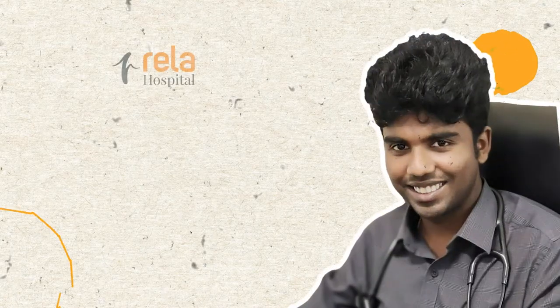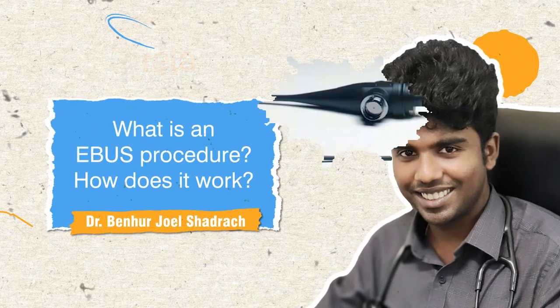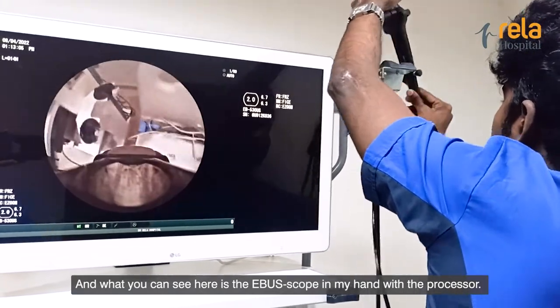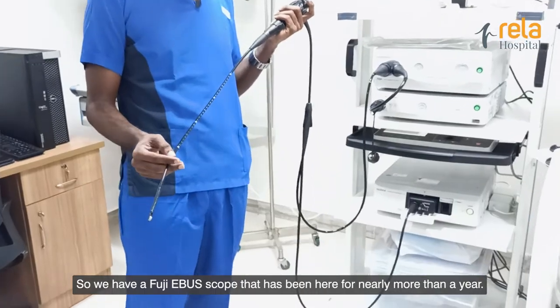Hey everyone, this is Dr. Benhur Joel, clinical consultant and interventional pulmonologist at Dr. Rela Institute and Medical Center. This is our bronchoscopy suite. What you can see here is the EBUS scope in my hand with the processor. We have a Fuji EBUS scope that has been here for nearly more than a year.